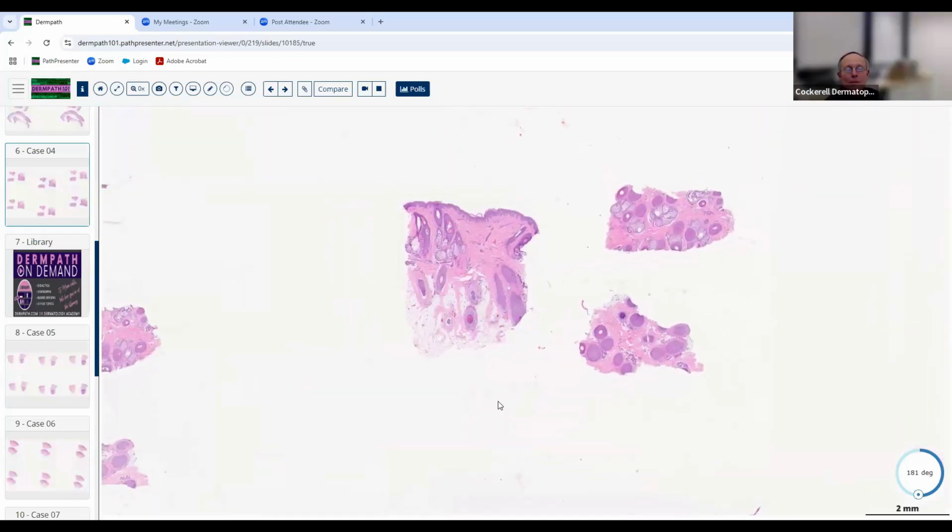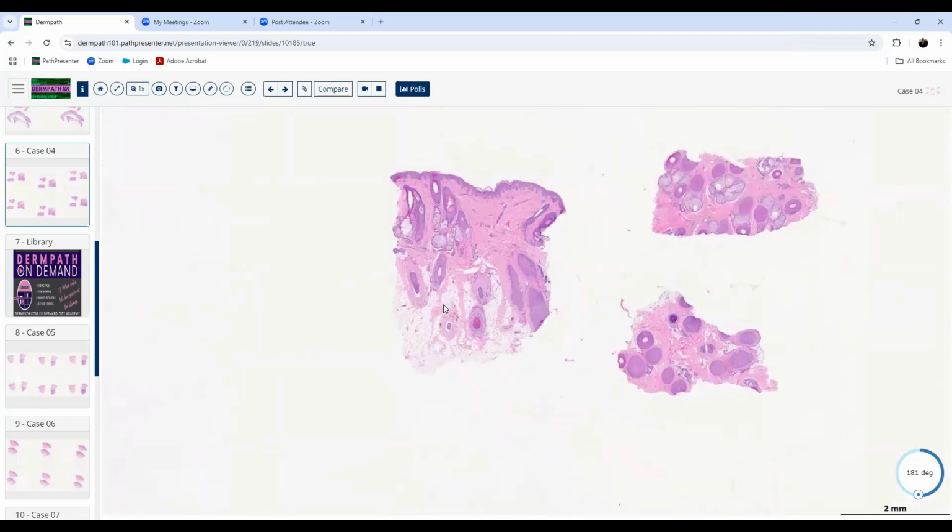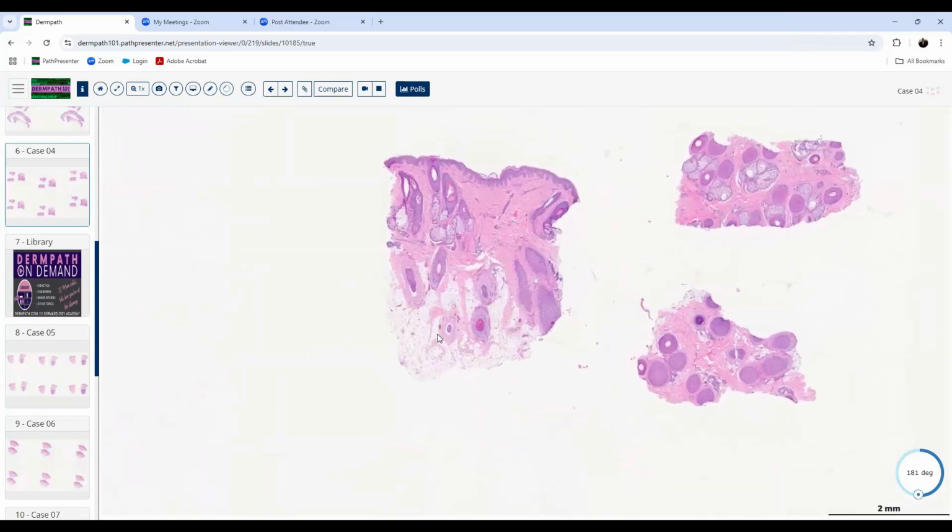Good. We're examining a punch biopsy that's been sectioned, or two punch biopsies for vertical and horizontal sectioning, which drives us to assume that this is likely a workup for alopecia. When we look at the broad buckets of the types of alopecia, I don't see any scarring and I don't see any inflammation. As we continue here, for example on the left of the screen, we can see there's some trichomalacia in the hair follicles themselves and a normal number of hair follicles.